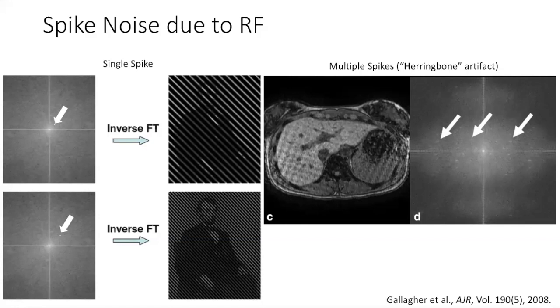Yeah, I guess in this case there must be something in the images. I mean, the Lincoln images weren't acquired with MRI. No. There must be some feature in the images that is very strongly horizontal and vertical, so that it's showing up at all horizontal and all vertical spatial frequencies. Like maybe there's a border in the image that's somehow factoring in there. I'm not sure. I guess it just depends on the spatial frequency content of the image that you're looking at, or the object that you're interested in.